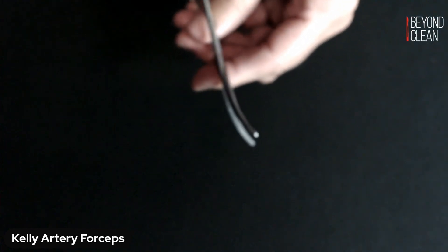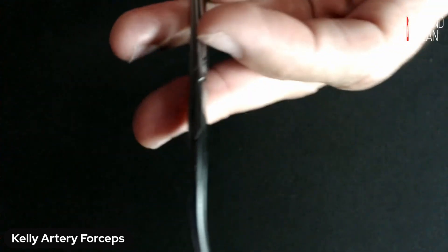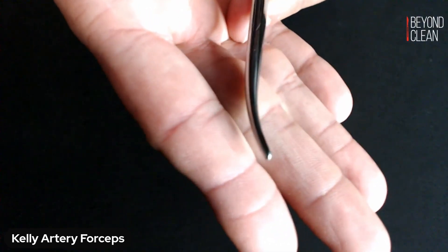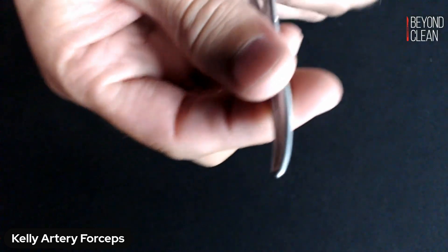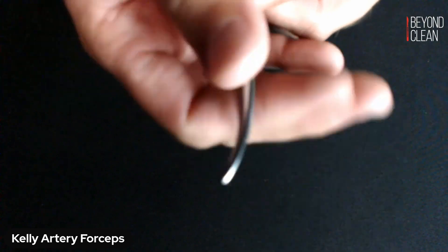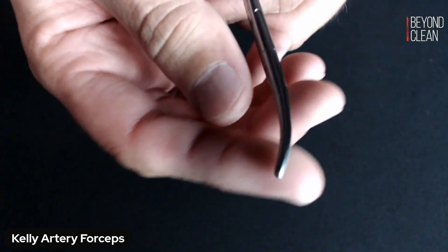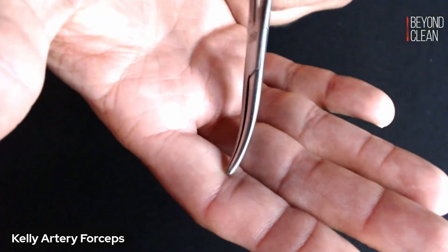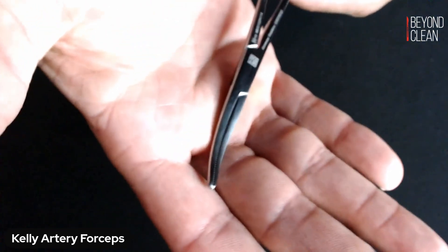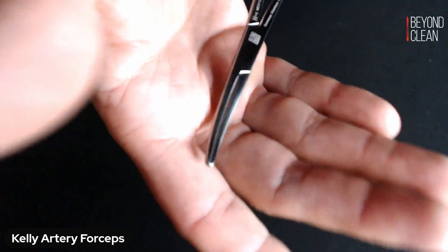Then make sure that your jaws are aligned. As this device is closing, you should not see any overlap of that jaw. This is a brand new device, so this jaw is completely aligned correctly. But if you were to close your device and you see some serrations poking out on one side or the other, that's a tip-off that there's been some kind of damage to the device. And if it's misaligned, it should not go back into your trays.